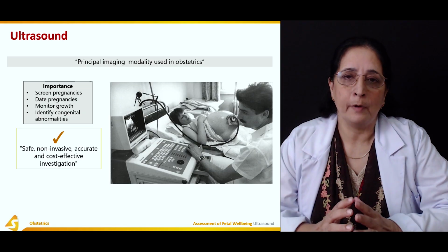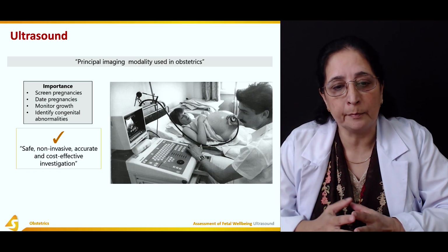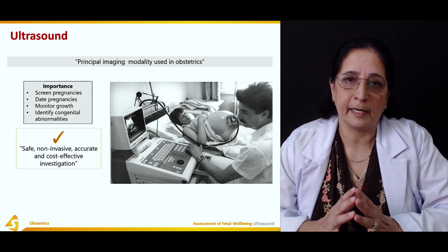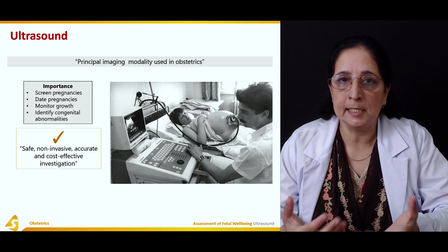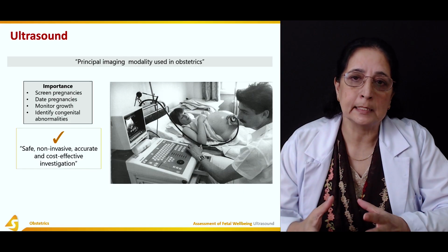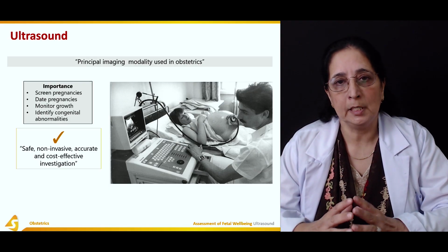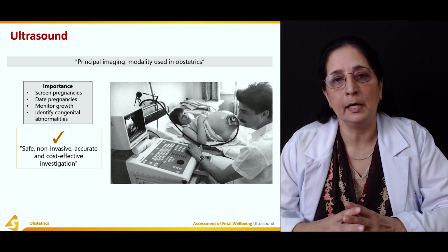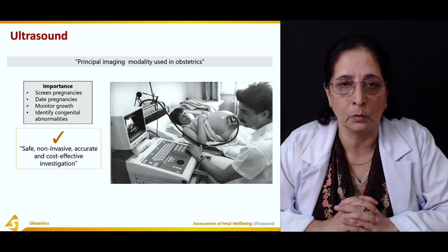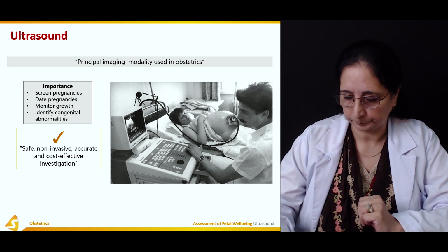Another advantage of ultrasound is that it is a non-invasive procedure, it's safe, and it's a cost-effective investigation. It's easily available in a lot of clinical practices and hospitals, and not very expensive, so every patient can easily afford this test.